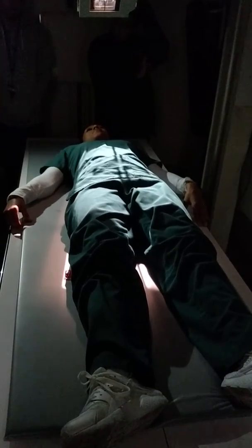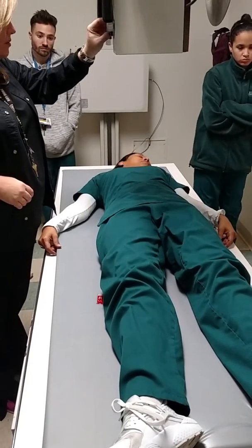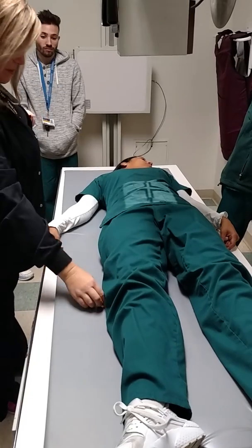This is an inlet. This is where the baby lives, and that's where the baby comes out. And remember, we go out the inlet and in the outlet. No rotation. We don't care about our legs on these certain ones. Now the posterior oblique. These are the Judet method. So 12 by 10. I'm just looking at acetabulum, just need a little light.